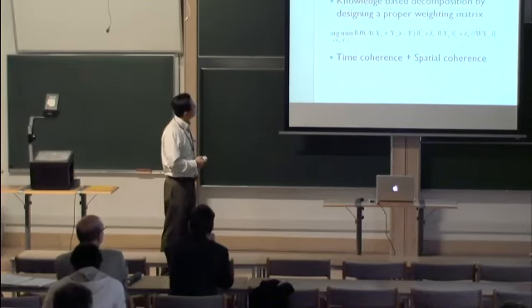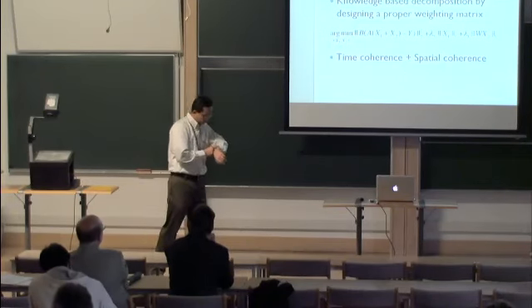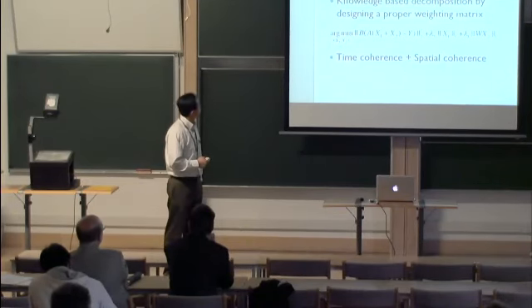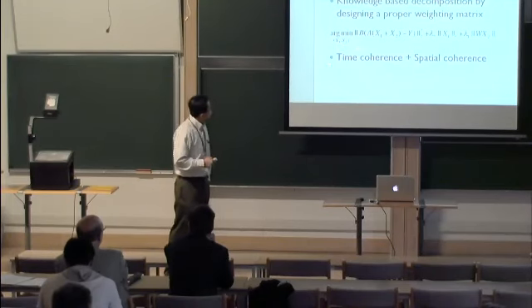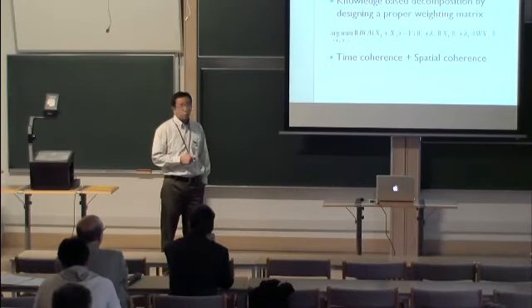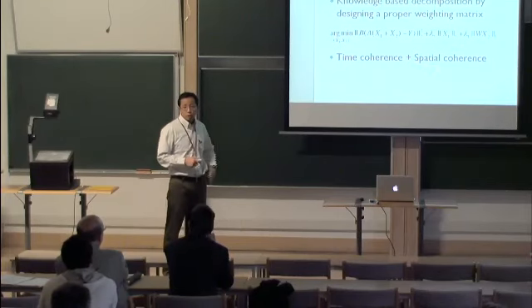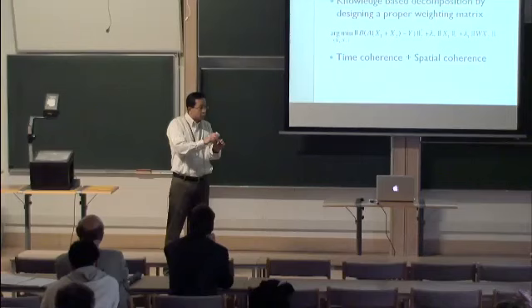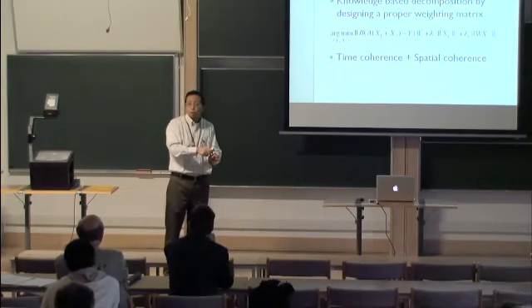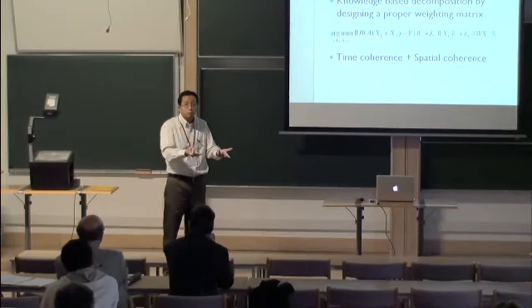So you construct some knowledge-based weighting matrix. And also, time is almost up. Here we explored time coherence most of the time, but we don't impose any spatial coherence. So for example, if you don't have measurement at one pixel in all phases, you have no way to recover it because there's no information there. But you can look at the spatial coherence, like in painting, to do that.